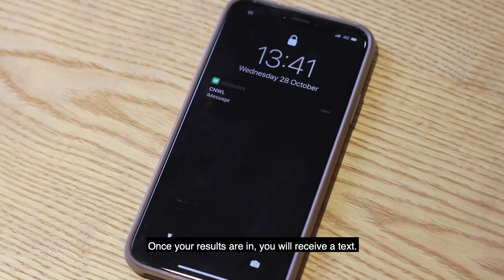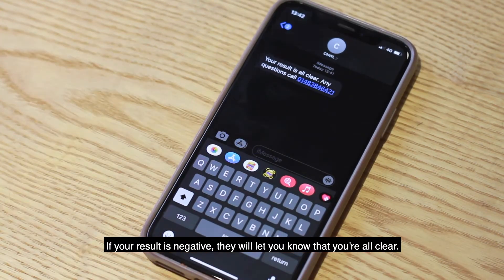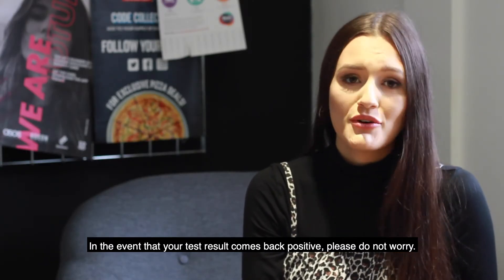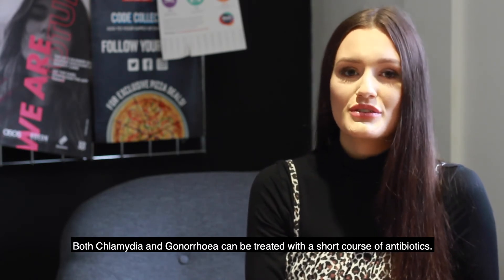Once your results are in, you will receive a text. If your result is negative, they will let you know that you are all clear. In the event that your test result comes back positive, please do not worry — both chlamydia and gonorrhea can be treated with a short course of antibiotics.